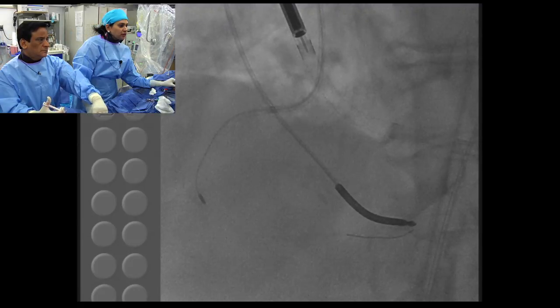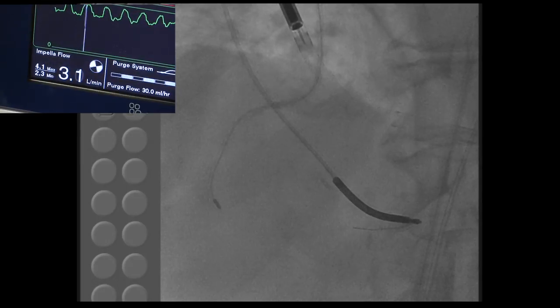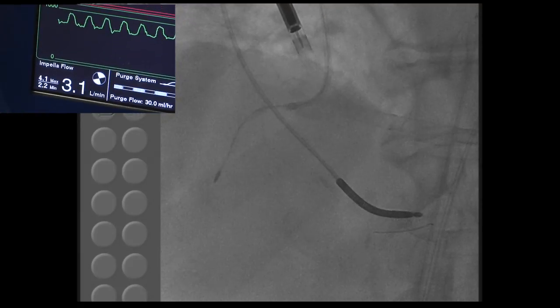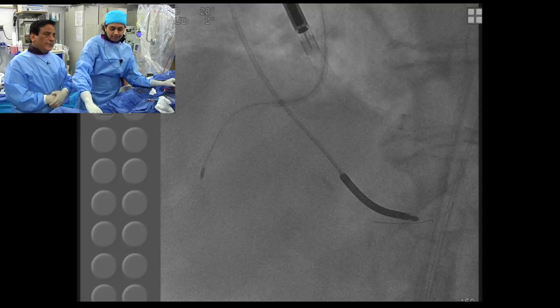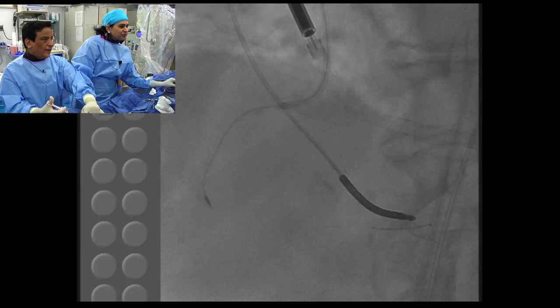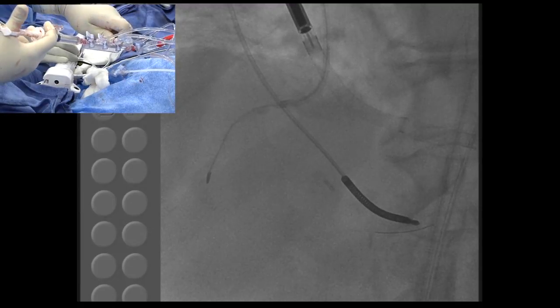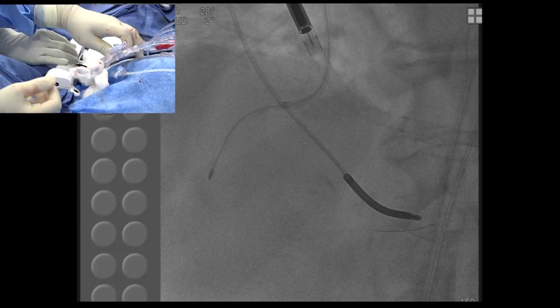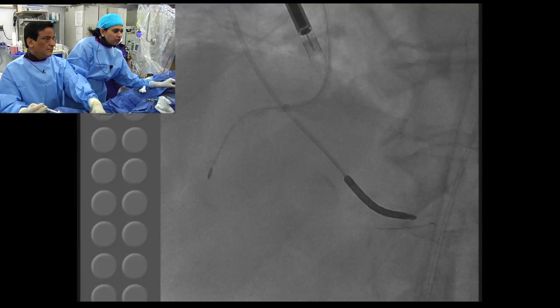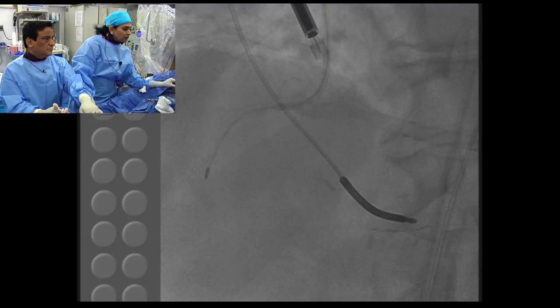41, 5 seconds. 42, 33. Same thing. You see, it's called pecking motion. You don't come back too much. Oh, the whole thing turned. That's why the guide was coming out, as I was advancing the wire a little further. 46, 45. Can you go at a little higher speed, please? Go there, like 160. But you see that it's a total wire bias. It is just working on one part of the vessel, the inside part. Go, good.